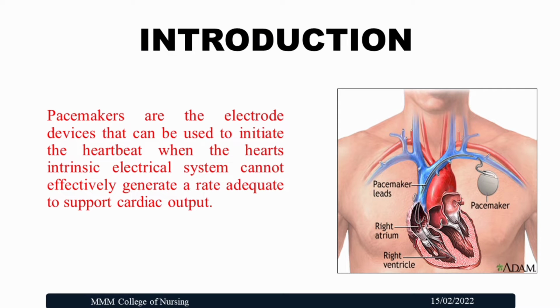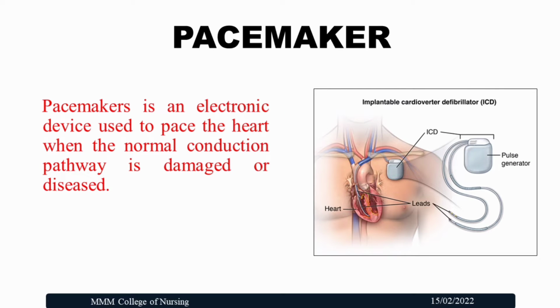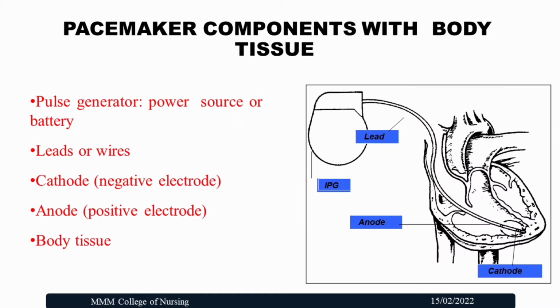Introduction. Pacemakers are electrode devices that can be used to initiate the heartbeat when the heart's intrinsic electrical system cannot effectively generate a rate adequate to support cardiac output. Let's see the exact meaning of pacemaker. A pacemaker is an electronic device which is used to pace the heart when the normal conduction pathway is damaged or diseased.